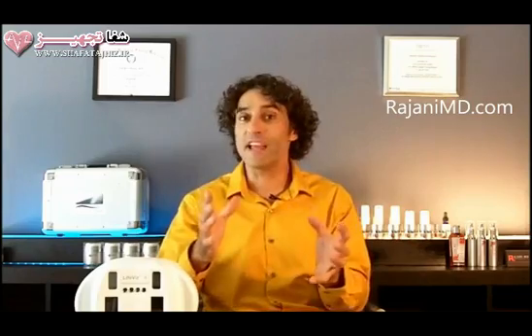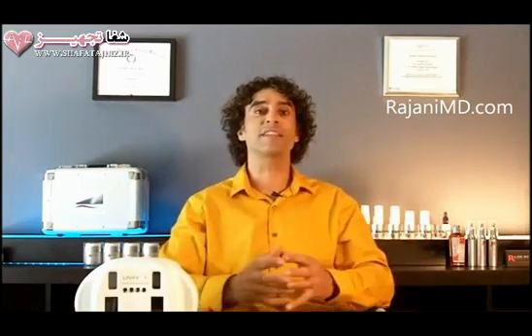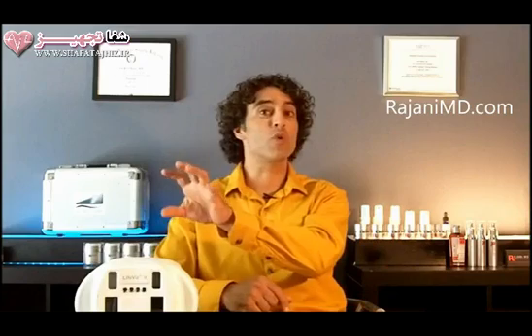Thus, patients see their face in 3-dimension, a view they've never seen before, and it allows the conversation between the physician and the patient so that they know you're on the same page and are looking to get the same results thereafter. Thus, you can get wow procedures. Patients come back and do more procedures and will do more quantity at a given sitting of procedures because that fear and anxiety is gone.